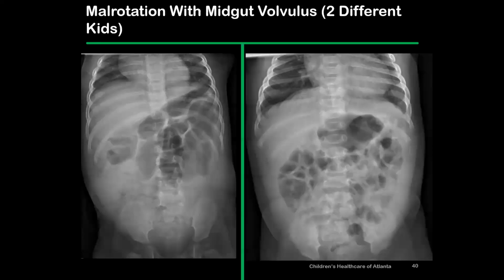So these were 2 kids who each had malrotation with midgut volvulus. This child didn't have any past medical history. He just had bilious emesis. And we can see that there are some bowel loops that are getting a little bit too dilated now in the upper abdomen. If we look at the interpedicular distance, those bowel loops are a little bit too wide.